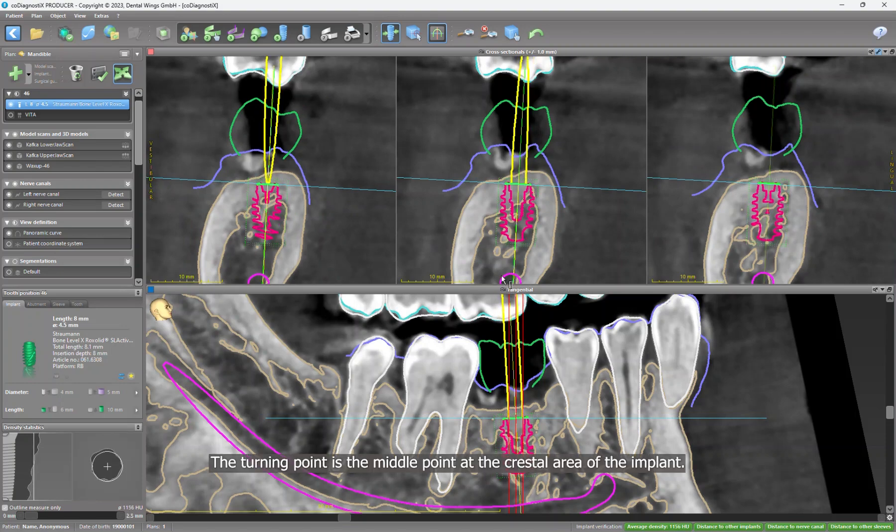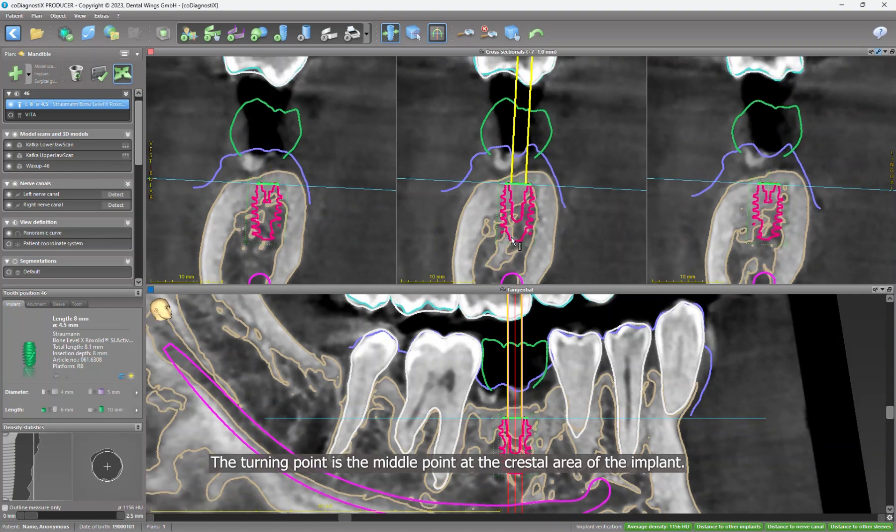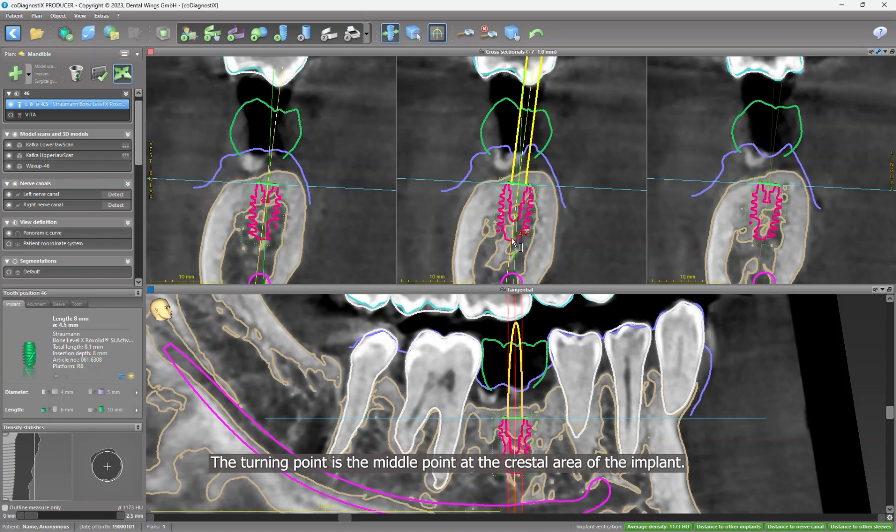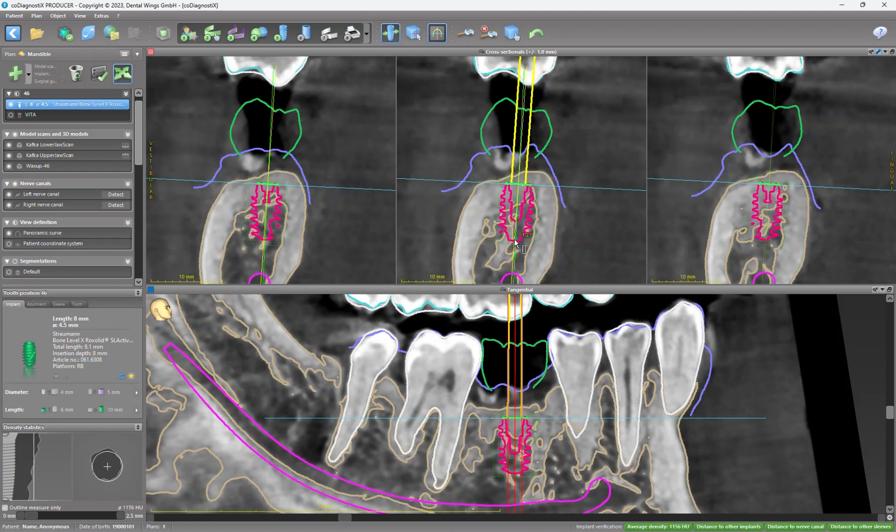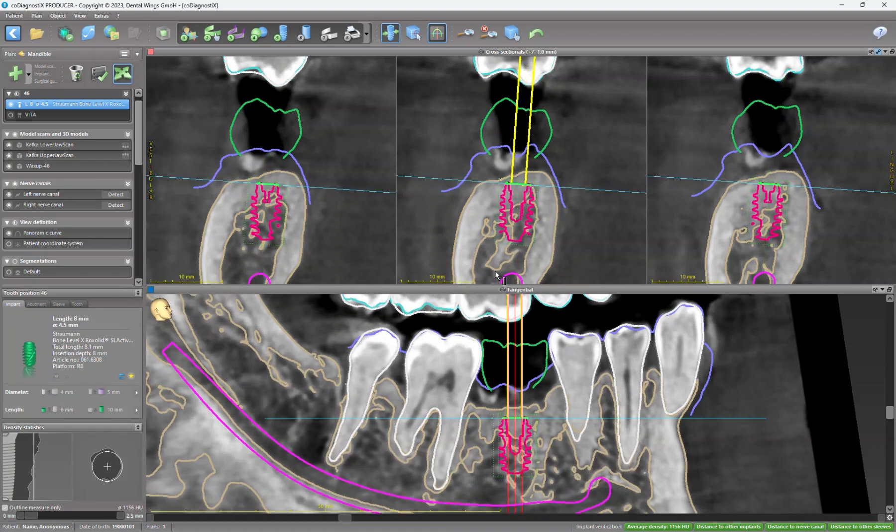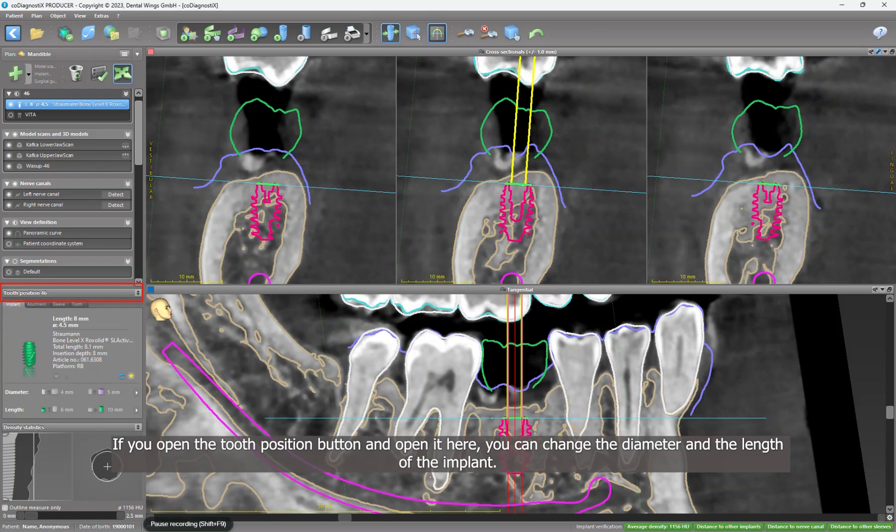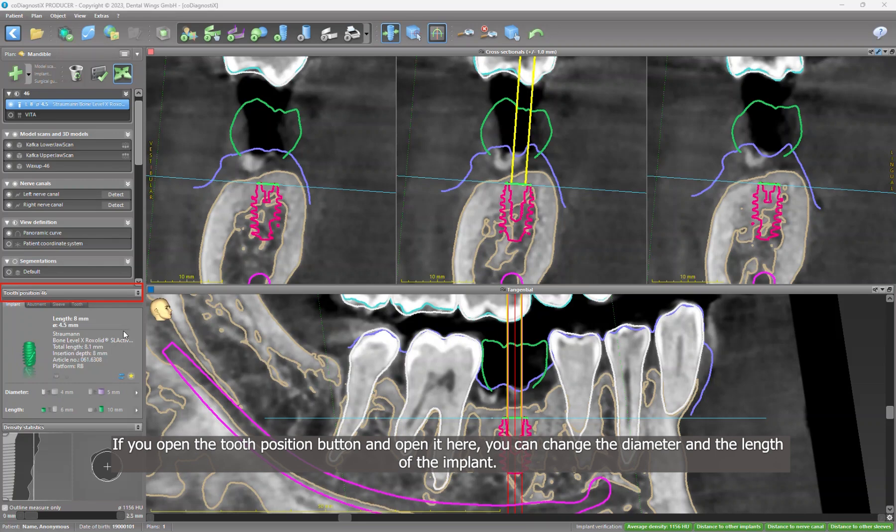So you can align the implants in both pictures. The turning point is the middle point of the crestal area of the implant. If you open the tooth position button and open it here, you can change the diameter and the length of the implant.